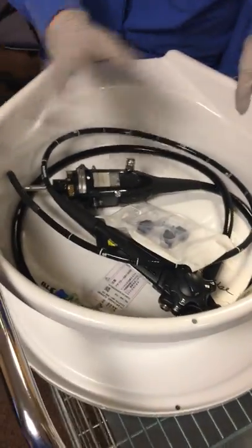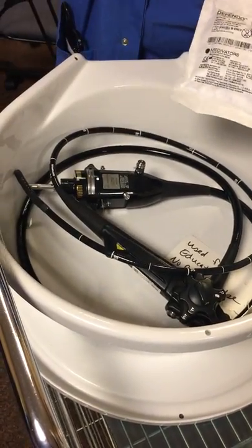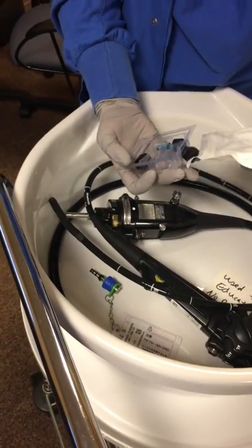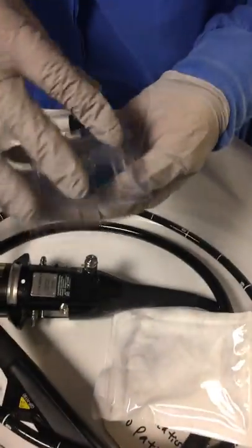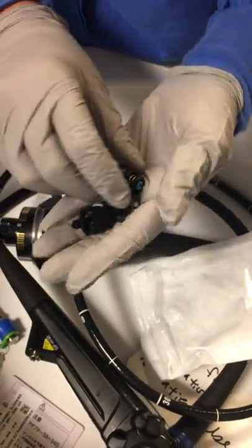Inside your container you should have the scope, your air and water buttons, an AW adapter, and a channel adapter. You're going to open your buttons — you should have three in there — and then connect those to your scope. On your scope there's a blue ring; blue goes to blue. You just slide it in and kind of twist down. Then you'll have another one with a red dot that's for suctioning — that'll go on the top. Twist that in. And then your third and final one, which you can use for irrigation, goes on the bottom.